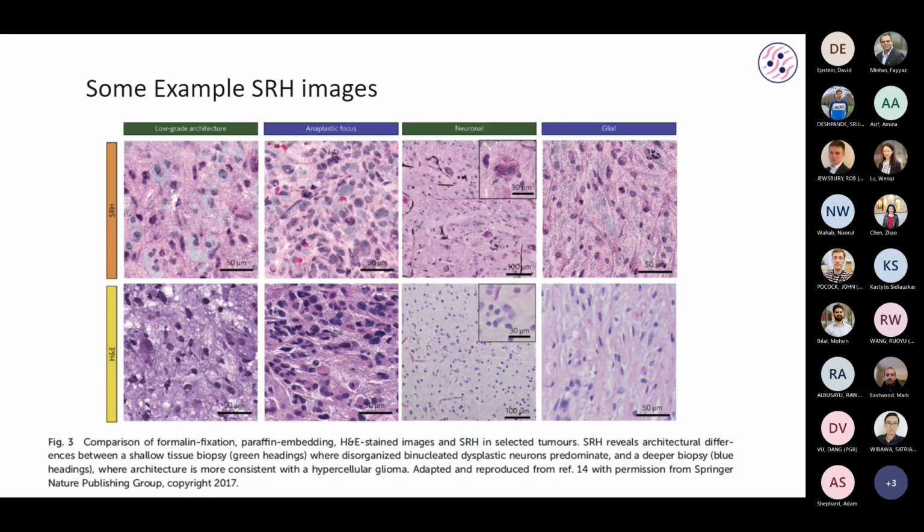Yeah, because speaking about high energy beam, there's a NanoString company which basically uses UV light to perform immunofluorescent multiplexes. And from the image they saw very high precision in the imaging compared to the usual staining. But because they use UV light in multiple beams, I'm not sure how much we will spend. The test didn't really try to answer that question.